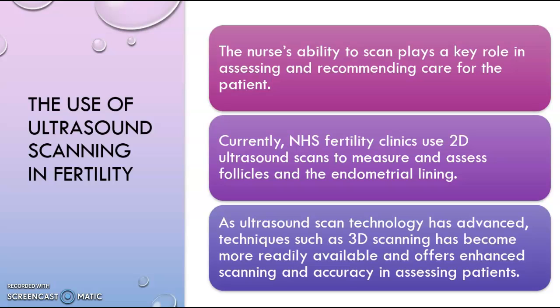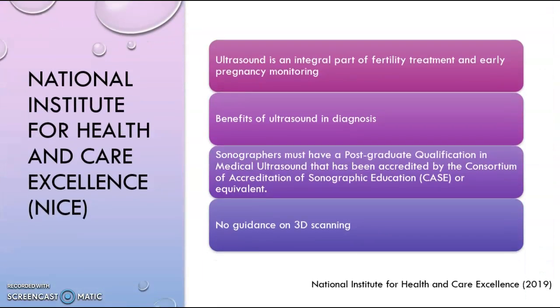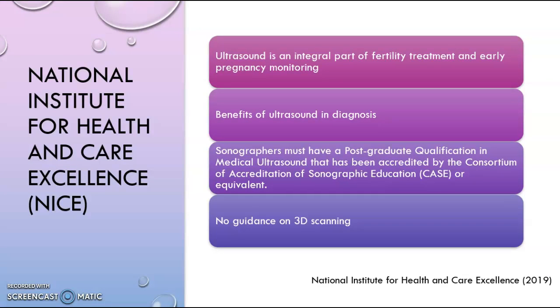This relatively new technique allows for more accurate scans, ensuring the patient receives the correct treatment. However, this is not routinely used within the NHS. NICE guidance discusses the full care for a patient undergoing fertility treatment and recognises that ultrasound is an integral part of assessing the patient through medicated stimulation, egg collection, embryo transfer or insemination, as it improves pregnancy rates.